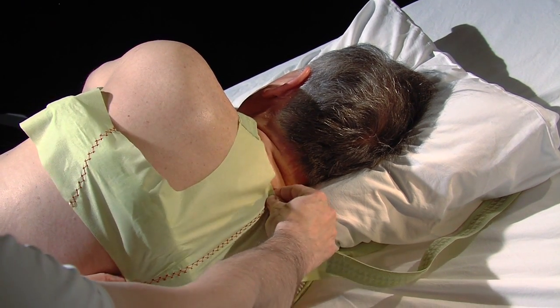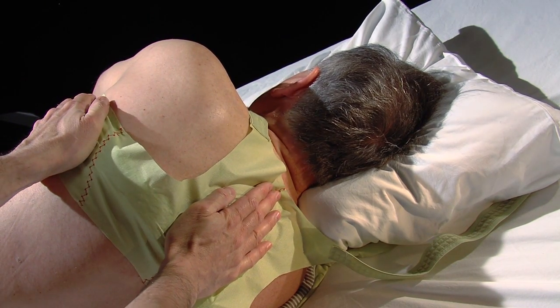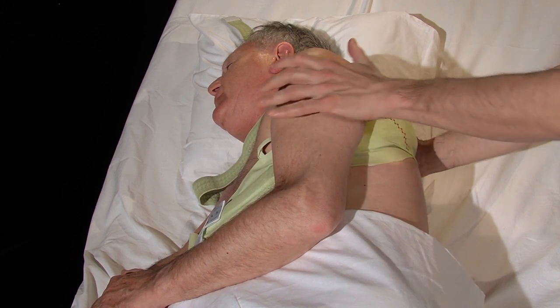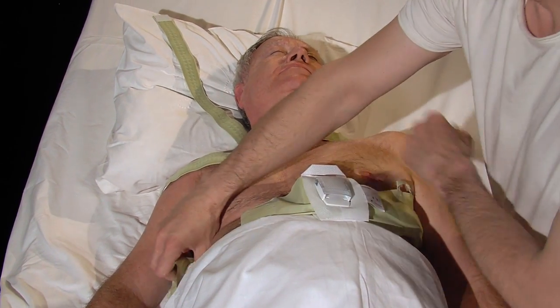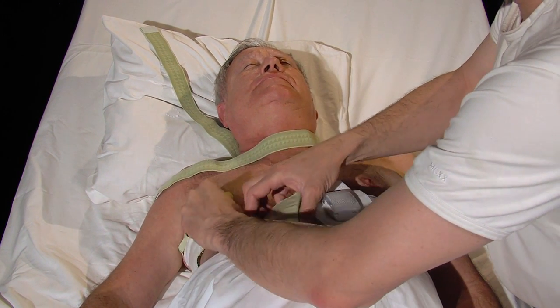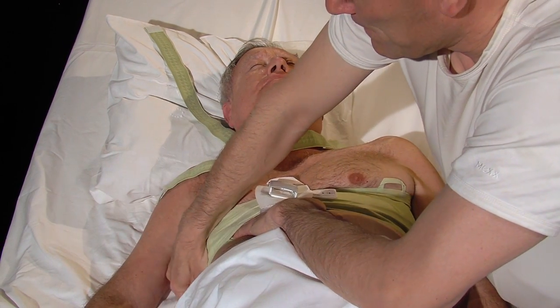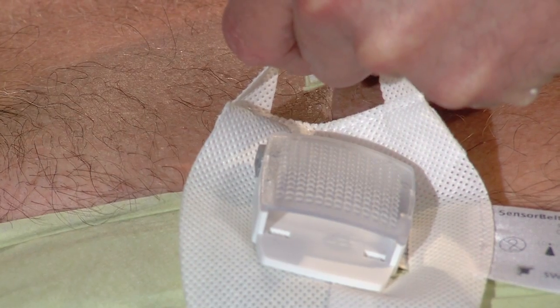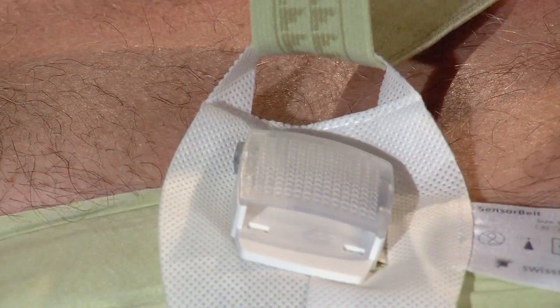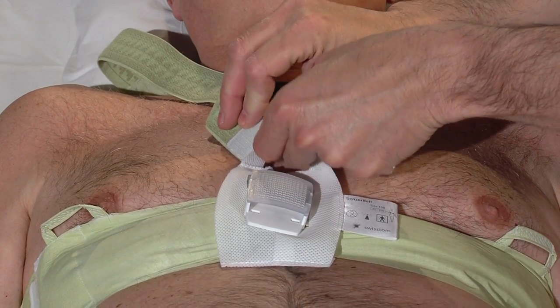Make sure the midline runs along the spine and the upper edge of the green fabric coincides with C7. Now hold the sensor belt in place with one hand while gently turning the patient onto his back. Pull the folded part of the sensor belt from underneath the patient and close it firmly but not tightly with the velcro from the other side. Run one shoulder strap after the other through the loop at the top end of the central cuff and fasten the velcros.